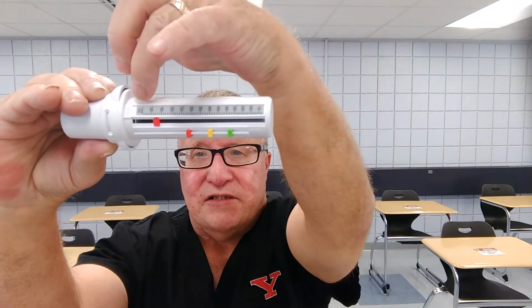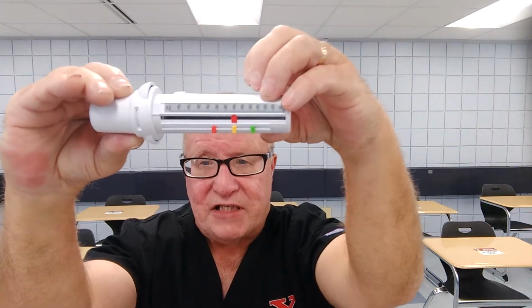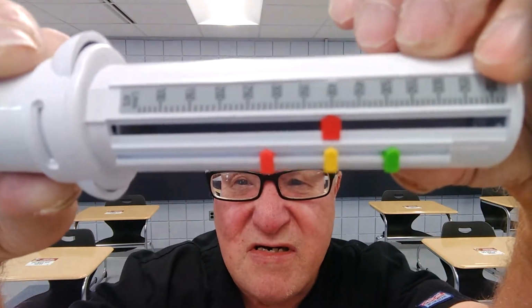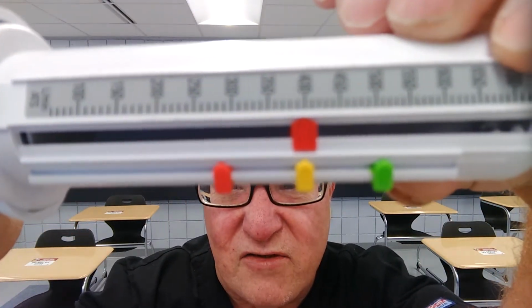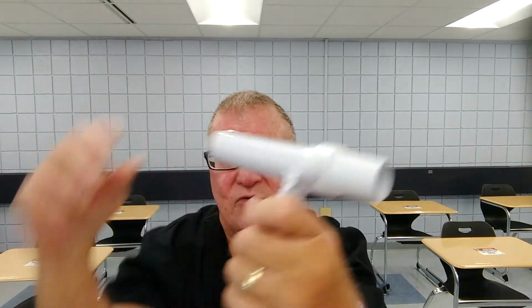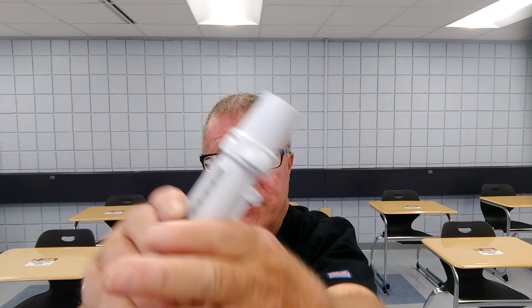Again, you see the scale here, and you see the red thing here. This moves, so when I blow out, this red thing moves up, and then I can read the scale, and that's your peak expiratory flow. Now, if you can really see that real well, try to steady it. It's not real good, but again, this is one example. This also has a handle on it, which is nice. You use that to blow through, pack it up, and like I say, they usually use it at home.